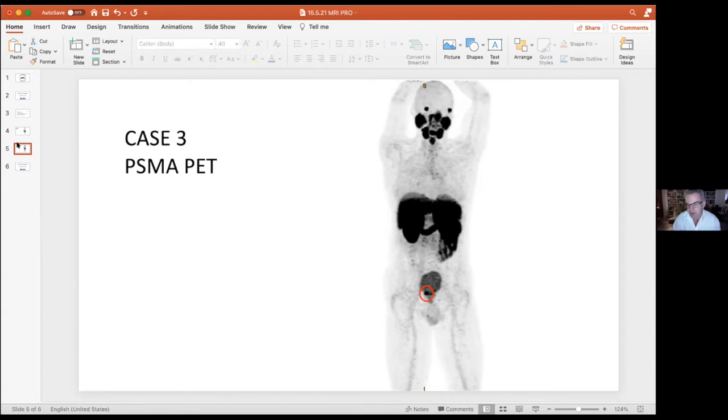So I think we should really strive and lobby for optimal setup. That's great MRI, fusion if you want it, and an appropriate place in which to do it. Yes, and perhaps arguably even more important with the prospect of potential focal therapy, where your accuracy is absolutely critical.